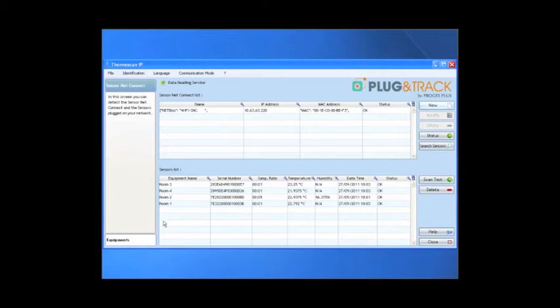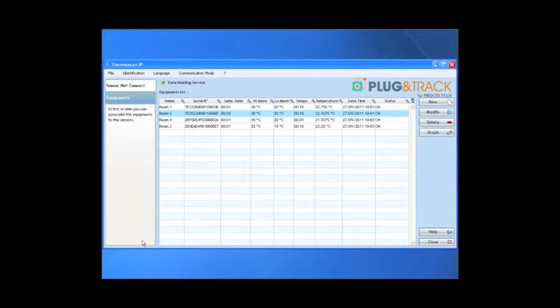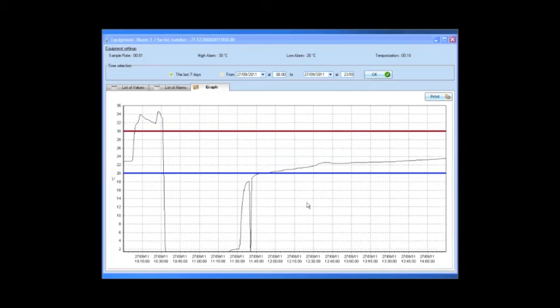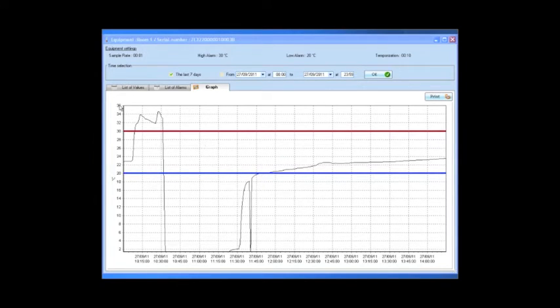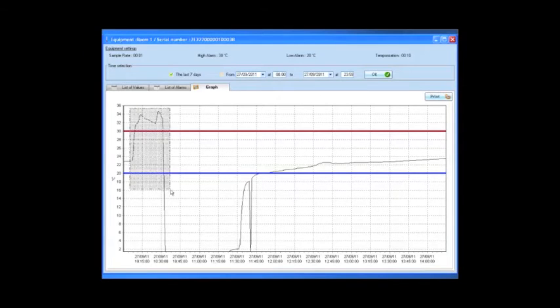Now, let's have a look at the graph. By default, you see the last 7 days. You can zoom on the graph to see more details.